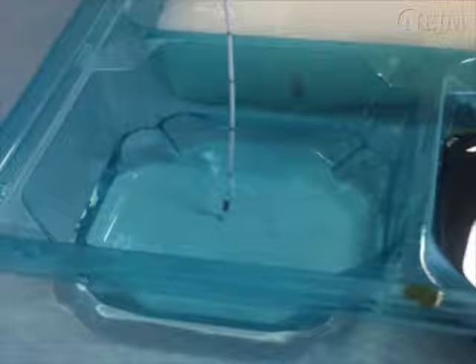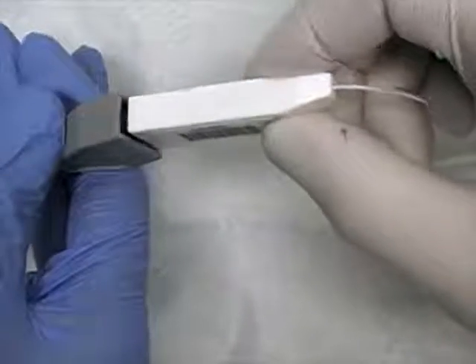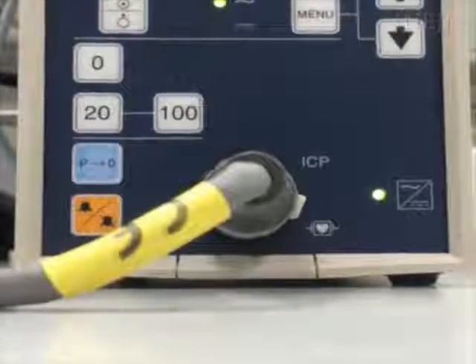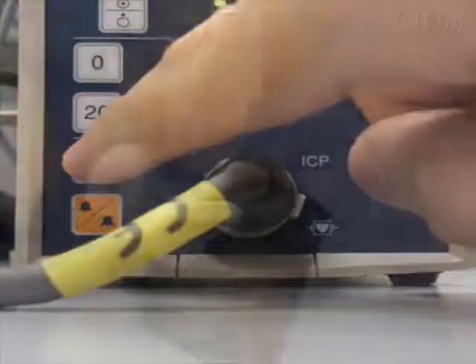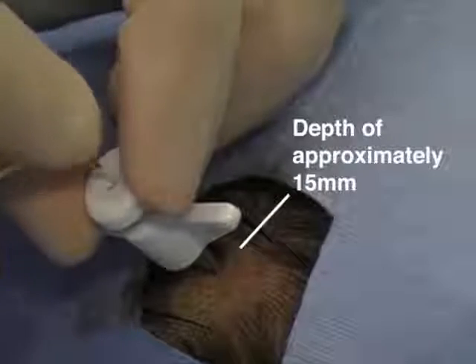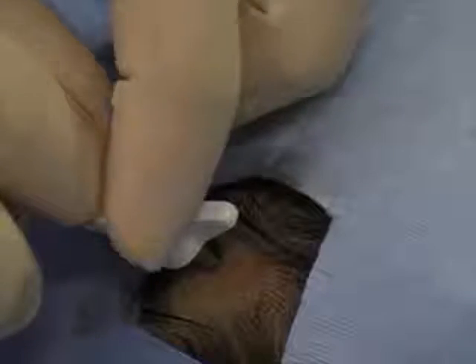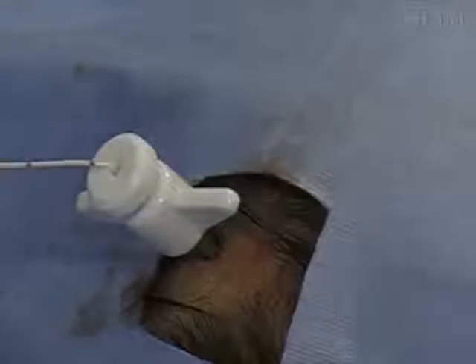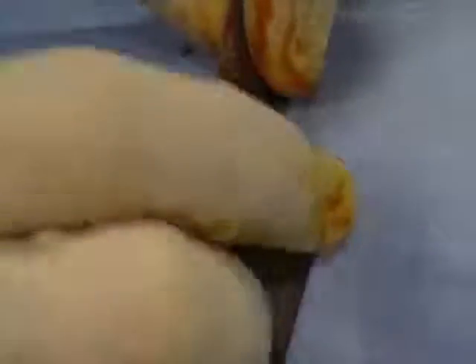Switch on the ICP transducer. Place the ICP sensor in sterile water and ask an assistant to connect the sensor to the transducer. Ask the assistant to calibrate the transducer and record the reference number. Insert the ICP sensor through the bolt to the desired depth, which is often approximately 15mm into the cranium, and then secure the sensor in the bolt by turning the adapter clockwise. When a strain gauge is used, a bend may be placed in the sensor at the desired depth, but other types of sensors should not be kinked. Dress the wound site using antiseptic-soaked gauze. You may place a purse-string suture, which can aid in wound closure after the bolt is removed.